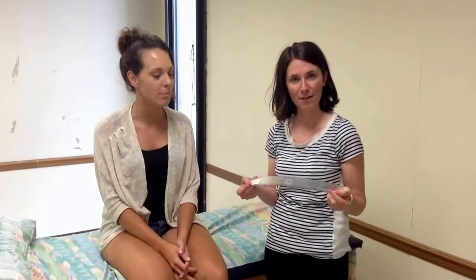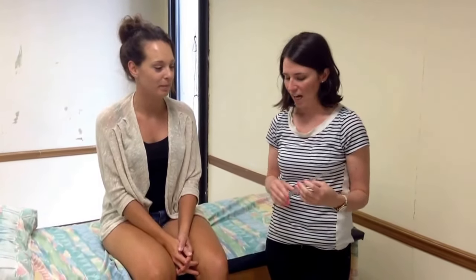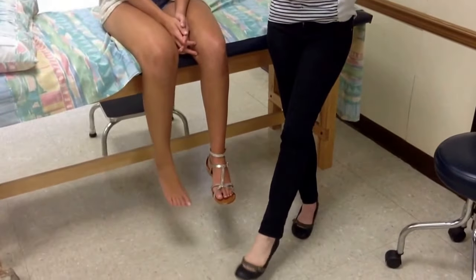For this video we're going to use our small goniometer and we're going to measure the ankle. Dorsiflexion and plantar flexion occur mostly in the sagittal plane.